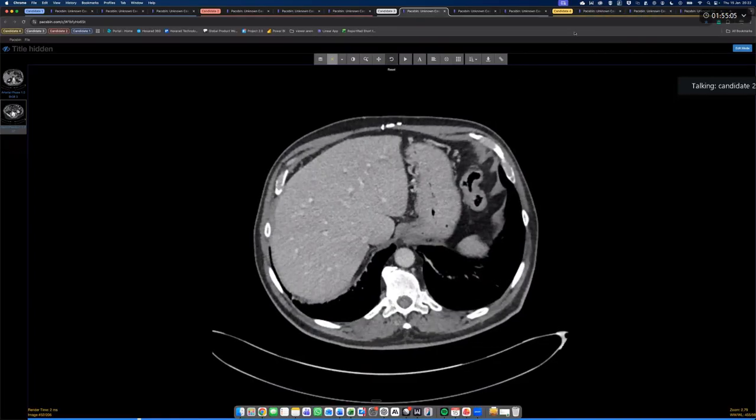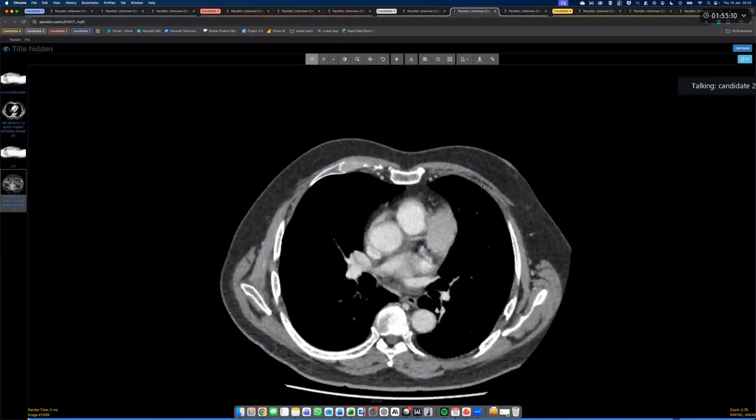Sorry, can I please ask about the lesion that I was assuming is in the head? It was a normal parenchyma. It was not a lesion in there? Normal. Yeah, okay. No, normal. Okay, thank you.